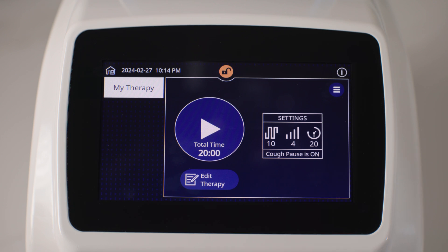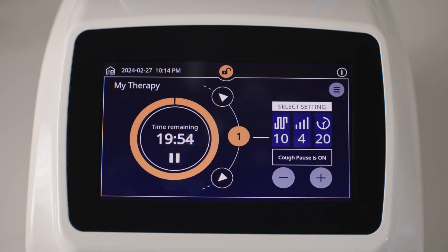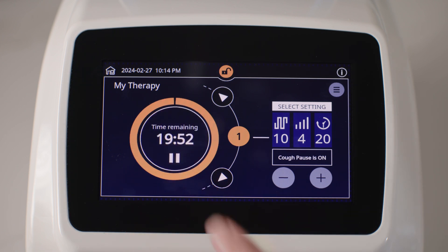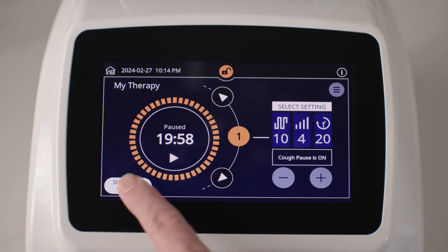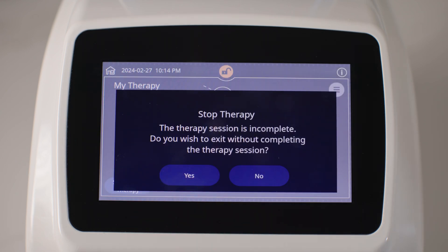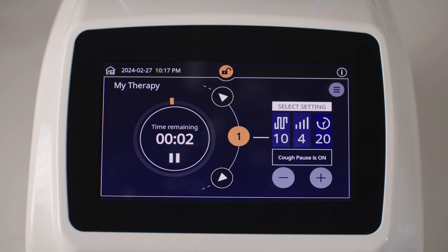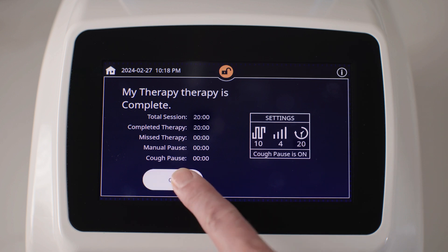Starting therapy in Basic mode is as easy as tapping the Start control on the display. To pause the therapy, tap the Pause control on the display. To resume the therapy, tap the Start control again. To stop and exit the therapy, tap the Stop and Exit therapy control on the display. A prompt asking if you would like to stop therapy appears — tap Yes to confirm, otherwise tap No to cancel. When therapy is complete, a summary screen appears with details about the recent therapy session. Tap OK to exit and return to the home screen.